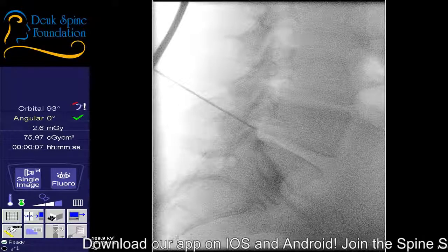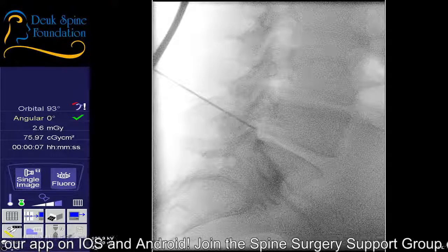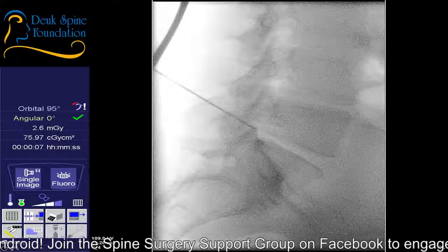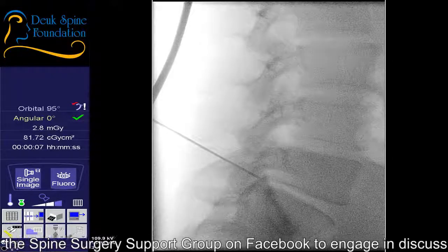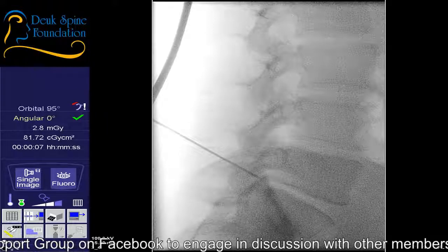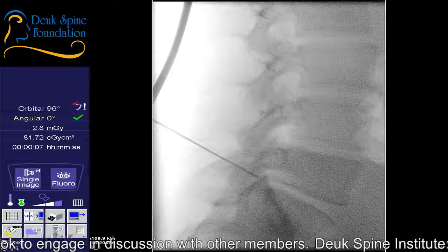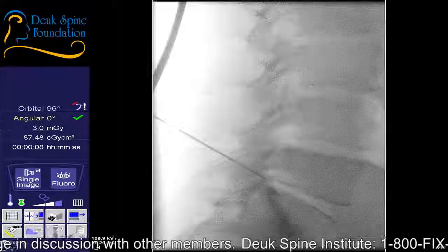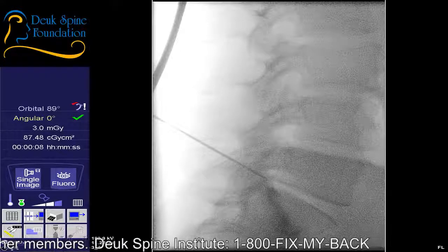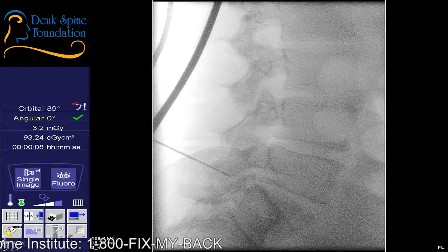I wonder if we could try wagging just a little bit and then this type of thing. Okay, you see the facets are not lined up properly. Shot. All right, now let's see, is that better? I think it's better, but it's still rotated. Let's go a little bit more and see what happens. Shot. I want to kind of look down the foramen. Let's go the other way. Go the other way. Stop. Shot. I think that's better. Yeah, that looks better to me. That looks better.